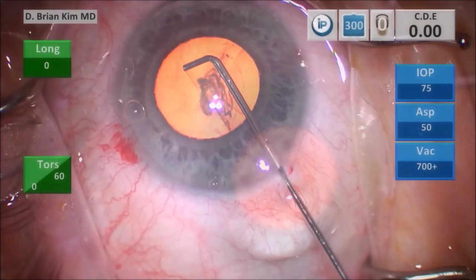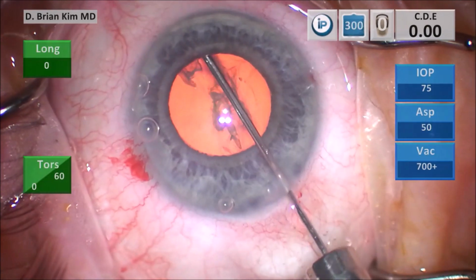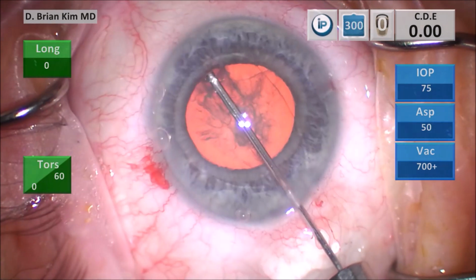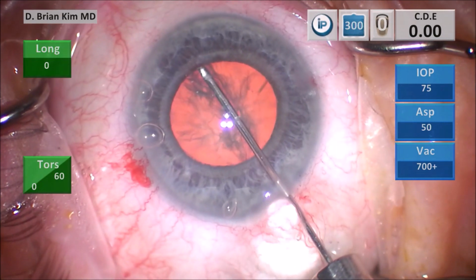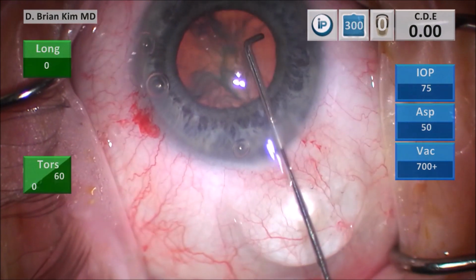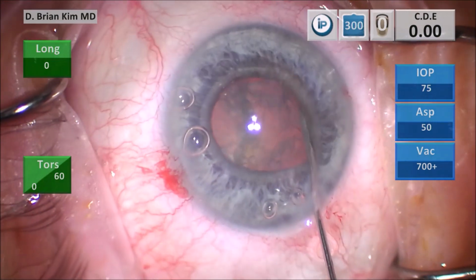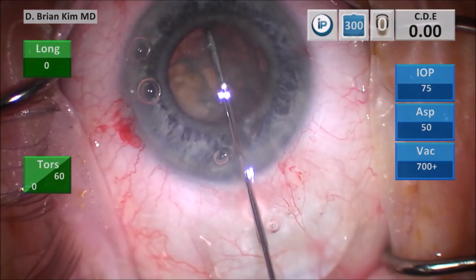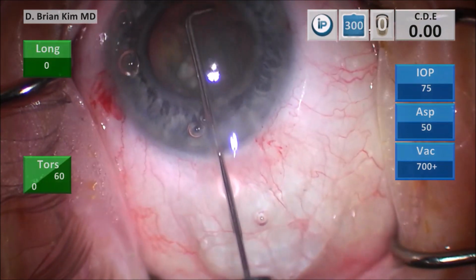I proceed with my capsular fornix hydrodissection technique. I place the cannula out to the equator contra-incisionally, going underneath the anterior capsule. Once I get to the equator, I rotate the cannula tip 90 degrees downward towards the nerve. I get a very nice fluid wave in the process of doing so. And then I burp on the left side, and then I gently spin on the right side, and you can see this lens is spinning very nicely.